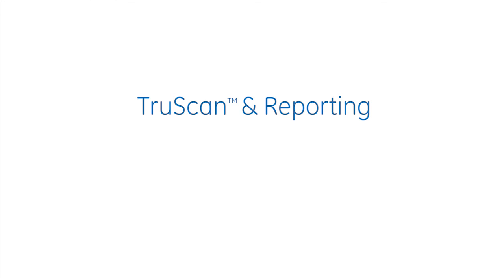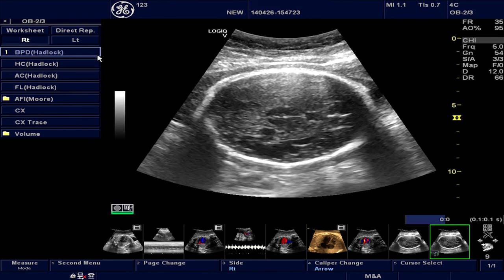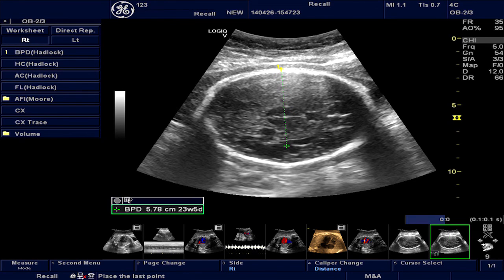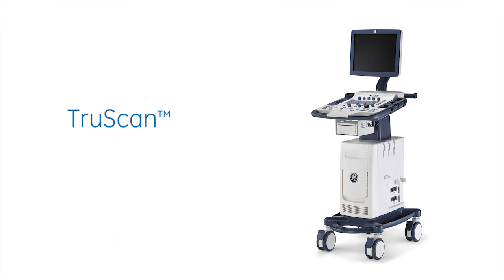TrueScan and Reporting: The raw data acquisition capabilities of the TrueScan architecture enable re-annotation and re-measurement while doing remote reporting on a workstation using a reporting software, if desired. This concludes the video demonstration of the TrueScan feature supported on the Logic Vision Series systems.